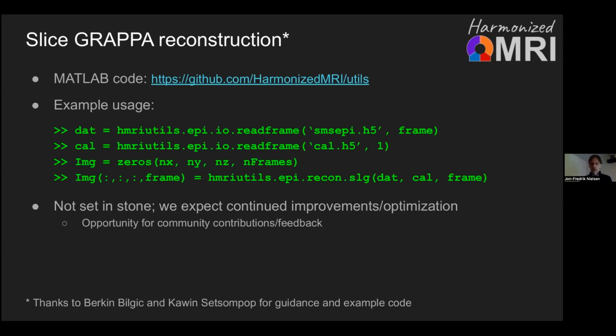There are some parameters that one can choose. So this is not set in stone, and we expect continued improvements, things like the regularization factor, and other things like coil compression that we can look into. But this is where we hope that the community can give us some feedback as well.